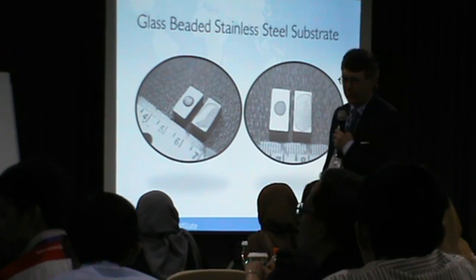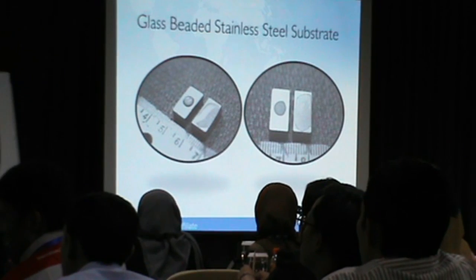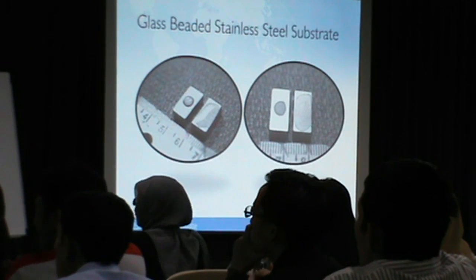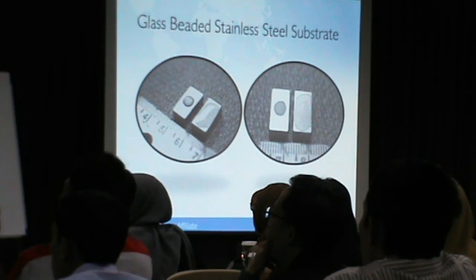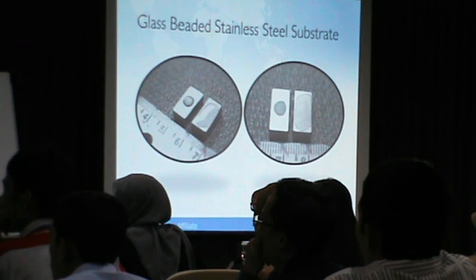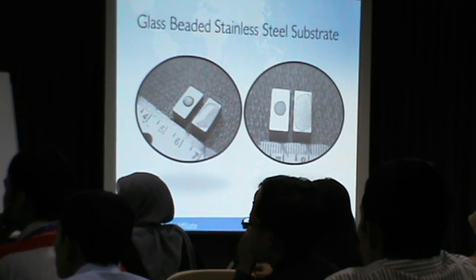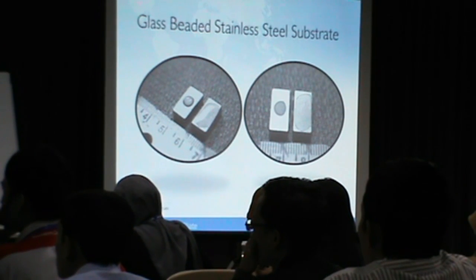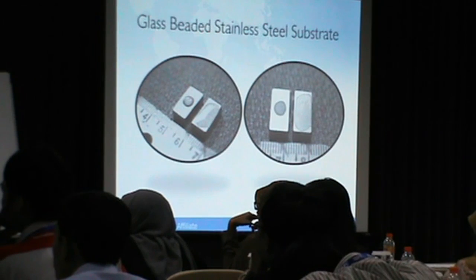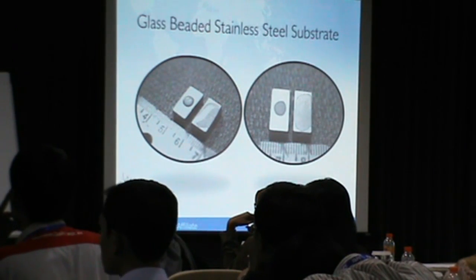I was telling you about the solvent. If you have a solvent with a high surface tension, like this, then when it dries, it's like this. Do you think that the spore distribution is fine, or can you have clusters?